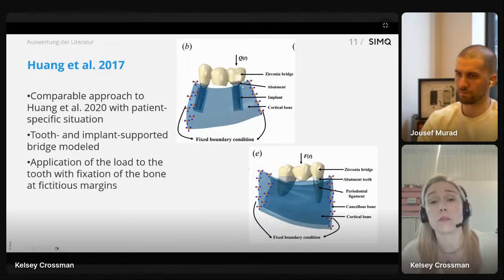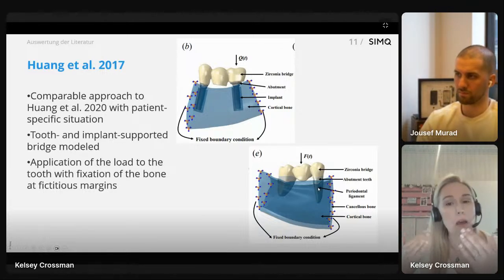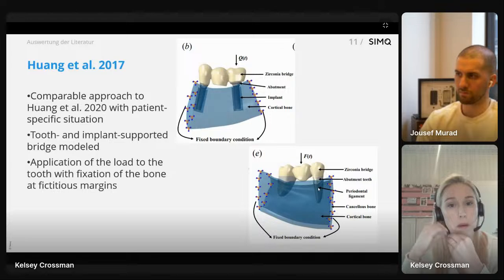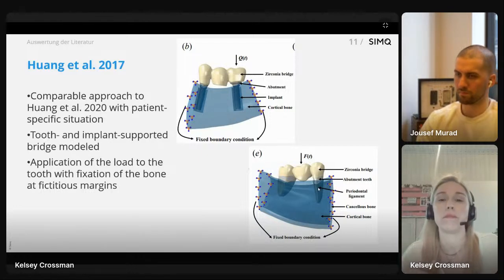And another example is with the dental workflow. You have different kinds of abutments, they're called, and some are metal and some are tooth supported. So the bridge or the crown can sit on top of a metal piece that's inserted by the dentist, or it can sit on a tooth that's maybe ground down a little bit, your natural tooth.